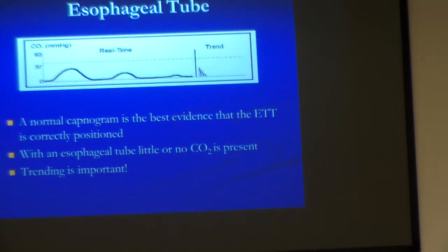Okay. Is there a code marker for ETCO2? No, it's just meds, I believe. Snapshot is easiest. It's better to do a snapshot than to try and mess around printing, especially if you're coding, don't be messing around. Just snapshot it. Snapshot's really nice because you just record, boom, and then you got it. Have somebody do it every 5 minutes, so that way you have a trend.